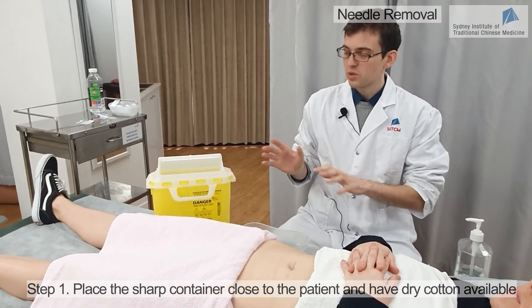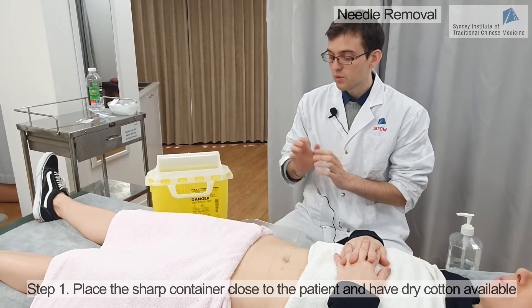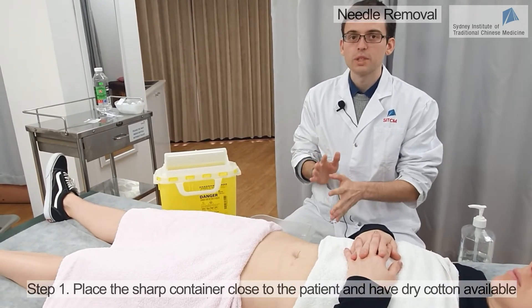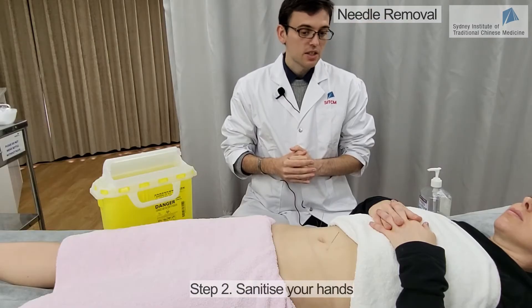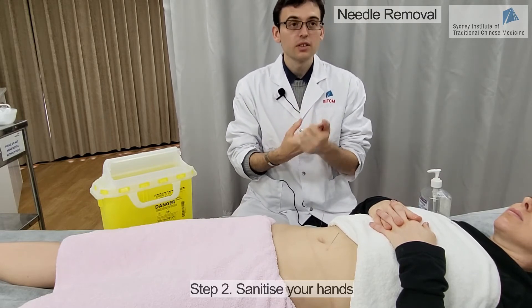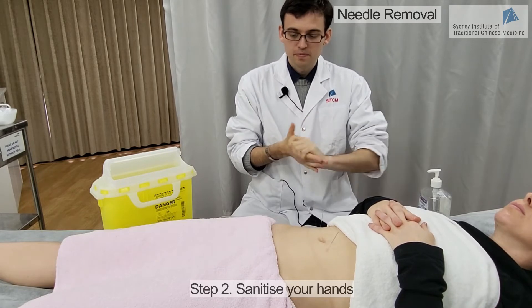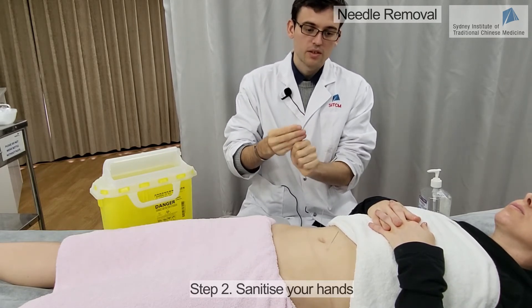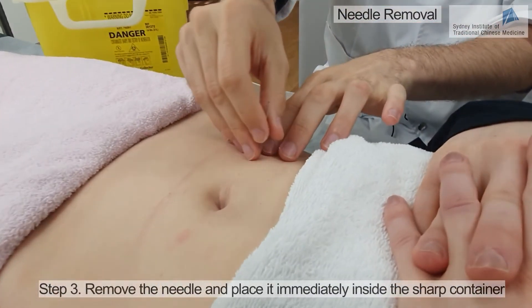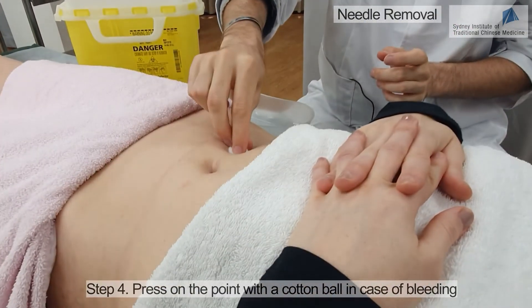Before you remove the needle, you need to make sure your equipment is ready — you have the sharps container very close to where you are going to take the needle out, and you want to have some cotton balls ready. Cotton balls are there because there might be some bleeding, and you want to control any bleeding directly after removing the needles. I will also need to wash my hands again before removing the needle. So I remove the needle gently and swiftly and place it directly in the sharps container. If there is any bleeding, I use a cotton ball to press on the acupuncture point.